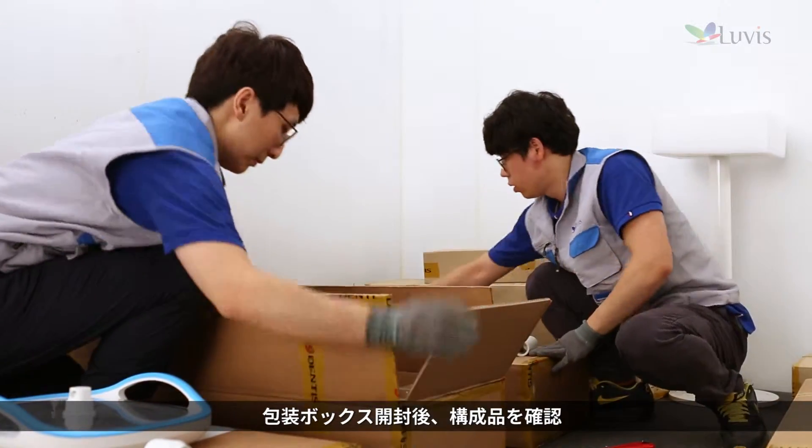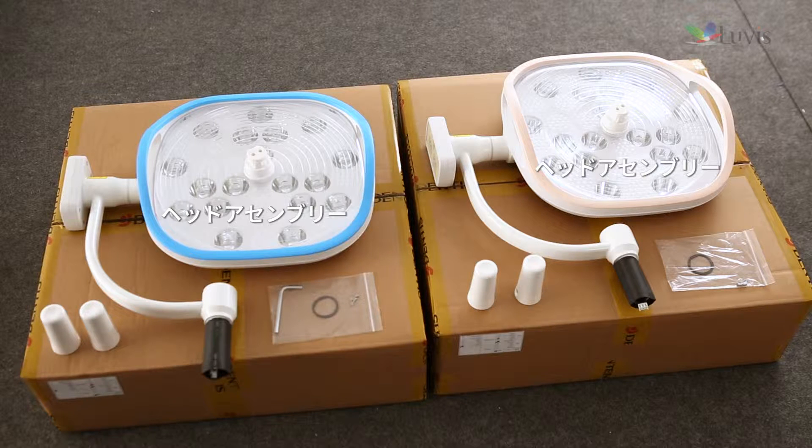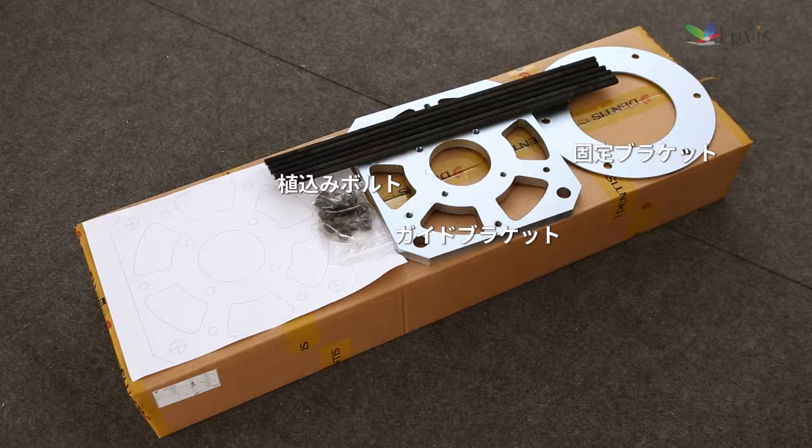Check components after opening the package box. Contents include: head assembly box; first horizontal arm 1 and wall second arm 1 and 2 box; dual ceiling vertical arm, ceiling cover, and ceiling cover bracket box; and guide bracket, fixing bracket, and stud bolt box.